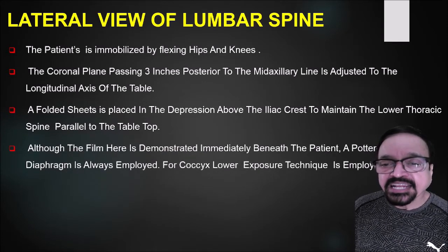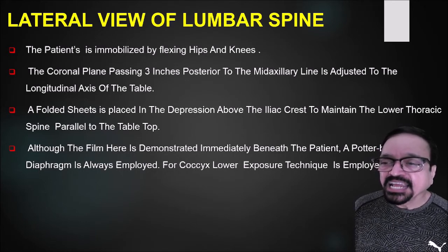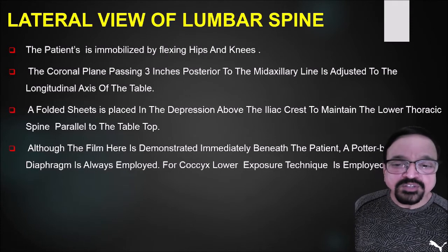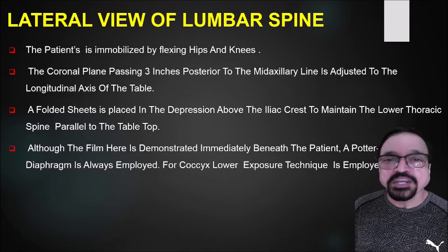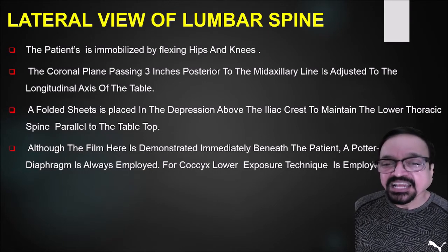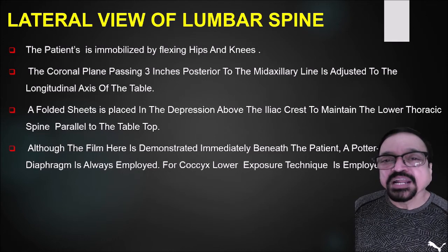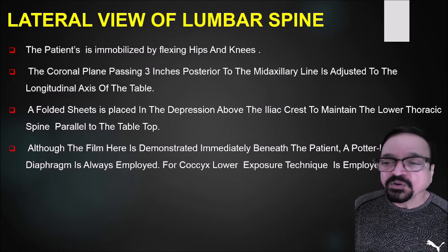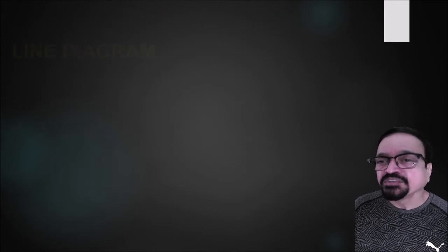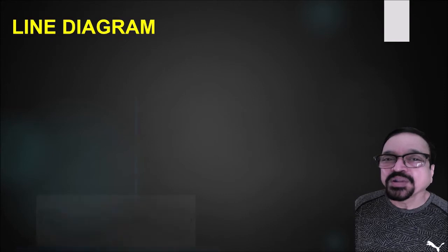Although the film here is demonstrated immediately beneath the patient, a Potter-Bucky diaphragm is always employed. The reason is that here what we used are the DR cassettes. Now Potter-Bucky are used for the CR cassettes. If you are asking for a lower sacral or coccygeal, then the technique employed is different. You have to get a softer exposure. They need less exposure because there is no iliac crest overlapping then.